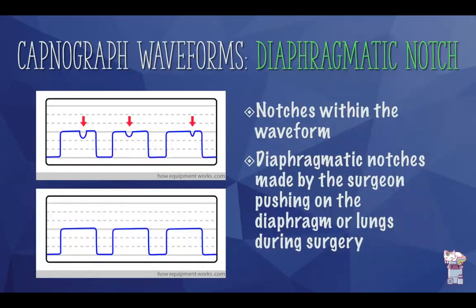Similarly, the diaphragmatic notch that can be seen here in this waveform forms when a surgeon pushes on the diaphragm or the lungs directly during a surgical procedure.